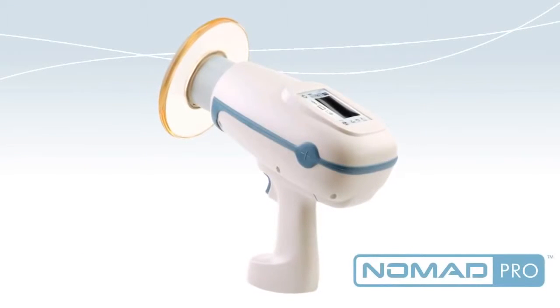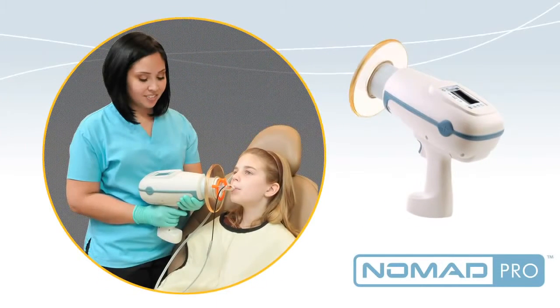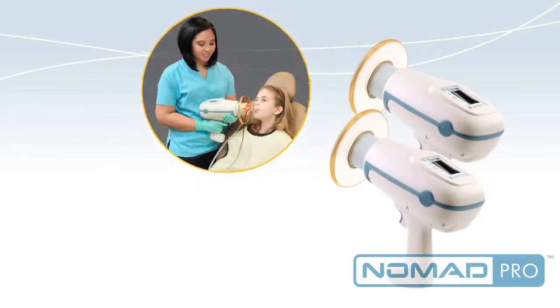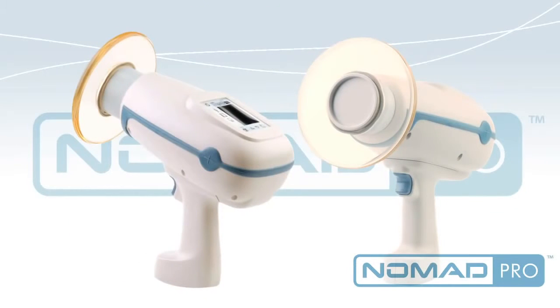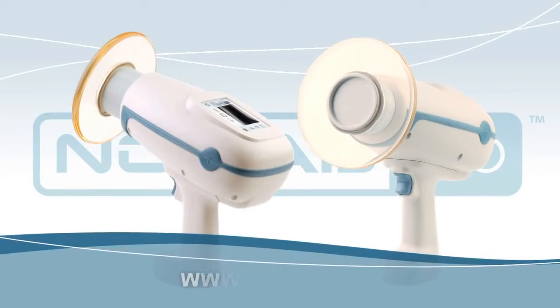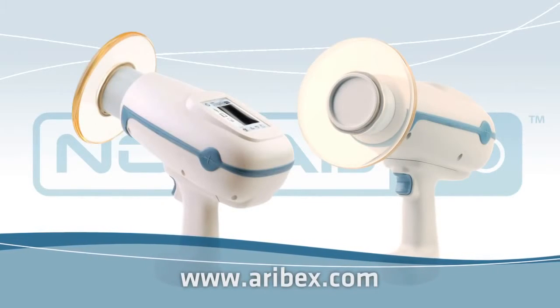Nomad Pro is convenient and cost-effective since it goes easily from room to room. Most offices would require only two Nomad Pros for every six operatories. Nomad Pro has changed the way intraoral x-rays are taken in the modern dental office. Starting now, being off the wall is a good thing.